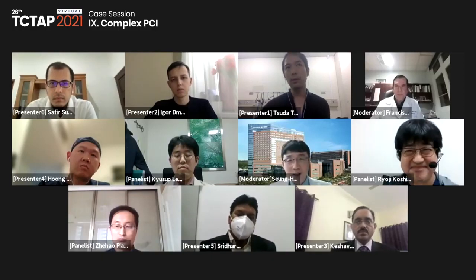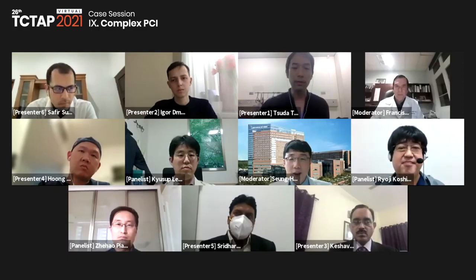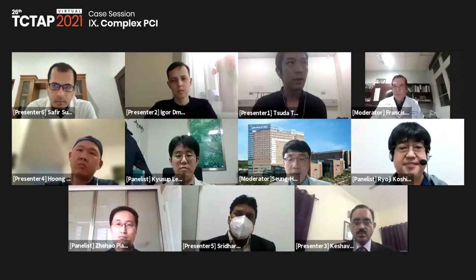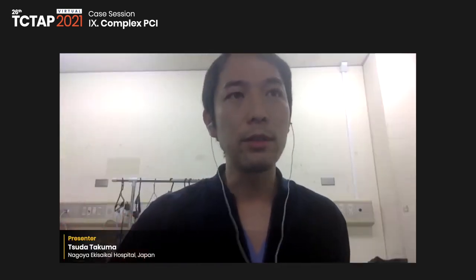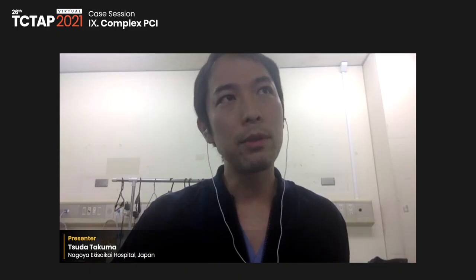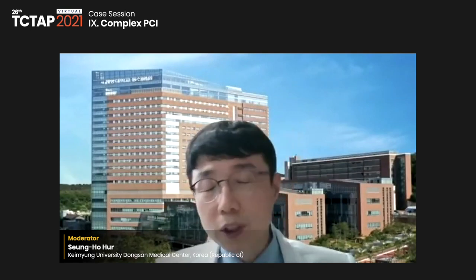It depends on the vessel size of the PDPL. This PDPL is very large, but a larger balloon is very traumatic, so I hesitate to use 2.5.